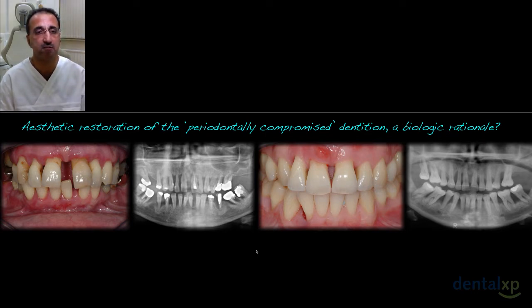But that does generally mean that you're going to need to flatten the bone, reduce bone, place the transition line above the lip line, and you're going to need to have shorter implants, larger prosthesis, and a prosthesis which is going to need to last many, many years, considering the ages of these patients.